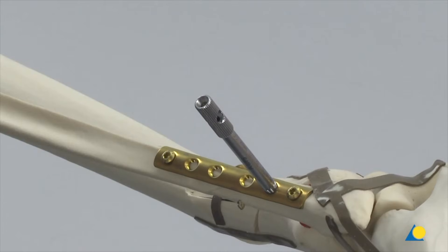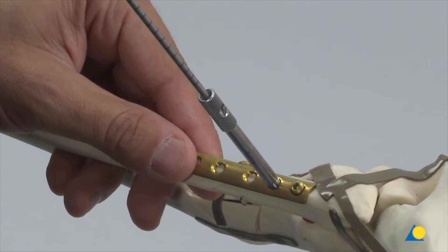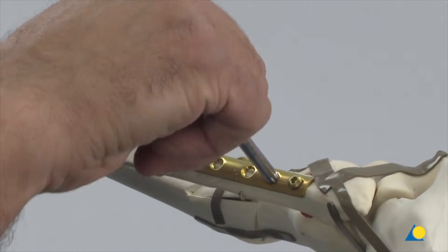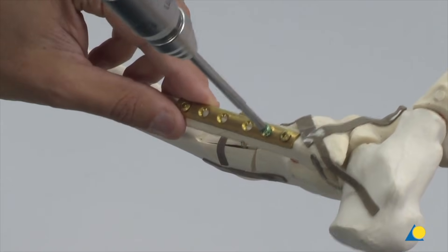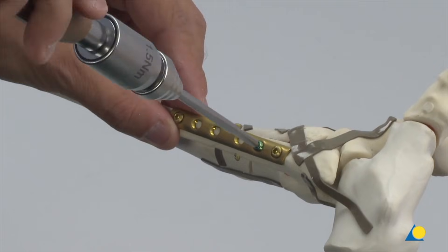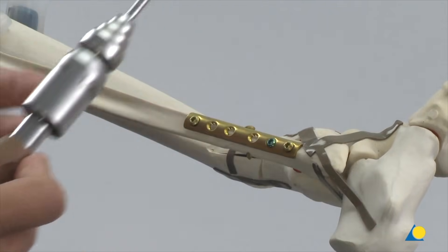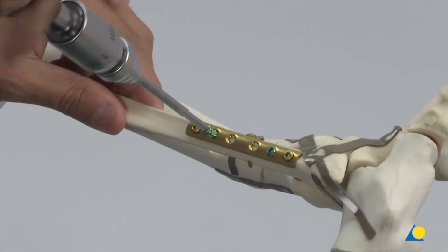The LCP drill sleeve 3.5 for drill bits 2.8 mm diameter is inserted distally. The hole is drilled and measured with the depth gauge. The torque limiting screwdriver 1.5 Nm is used to insert a 3.5 mm diameter locking screw. The process is repeated proximally and another 3.5 mm diameter locking screw is inserted.